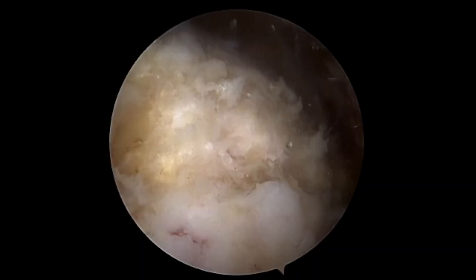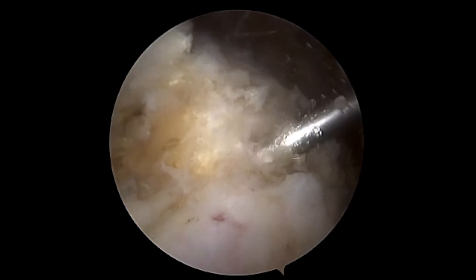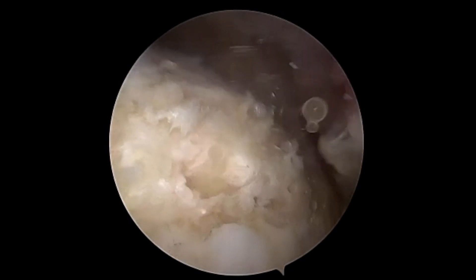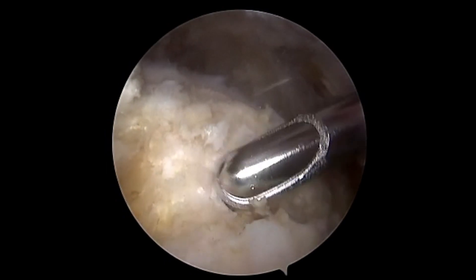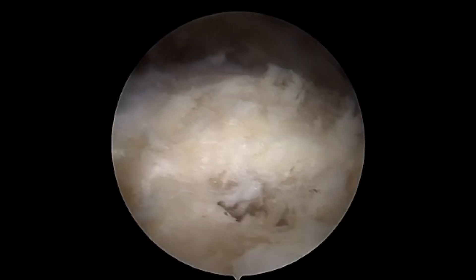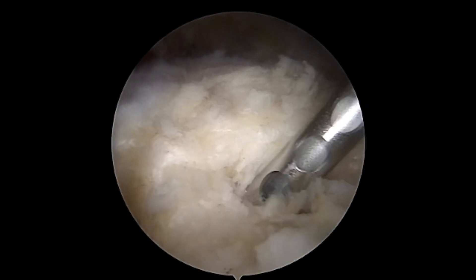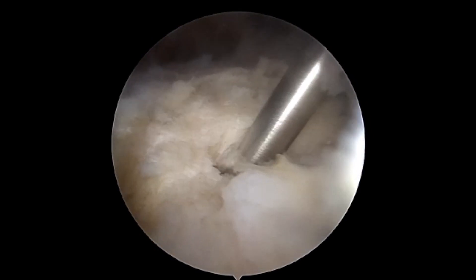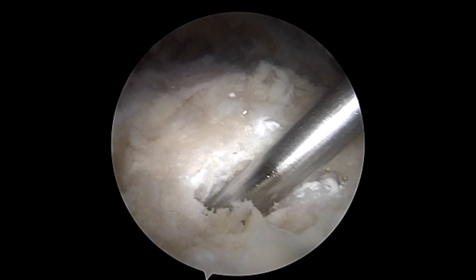One method to enhance fixation is to inject a bone graft material called Tactoset. First, the cyst is identified, and then the cyst contents are removed with the suction and shaver. The percutaneous cannula is emplaced into the cyst, and the Tactoset is injected.